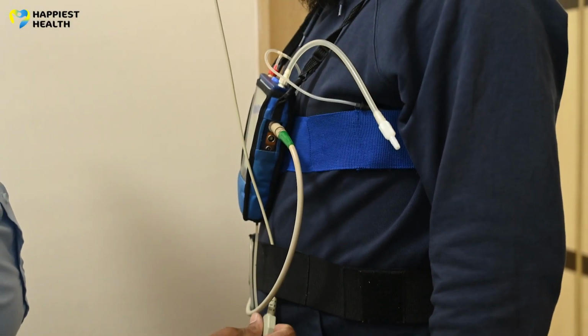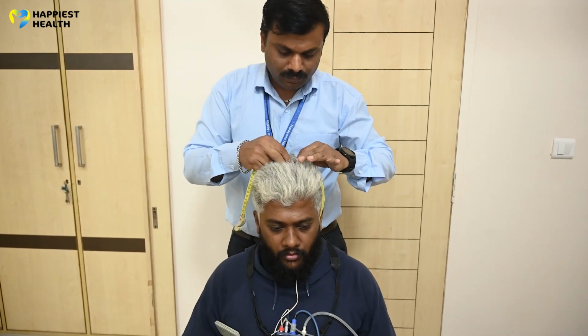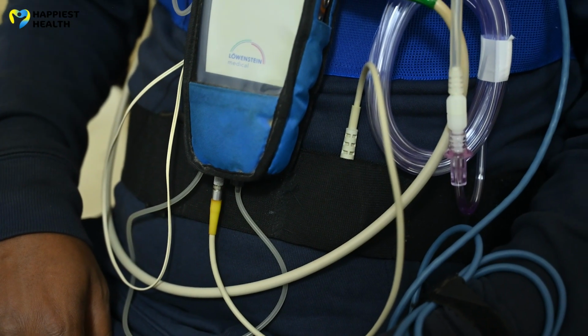There is a manual known as the American Academy of Sleep Medicine's Manual of Sleep Scoring, in which the first part is dedicated to how to hook up a patient. There are standardized points where each of these sensors has to be applied. Not only where they have to be applied, after application we have to do a calibration of all of these sensors, because these are sensors.